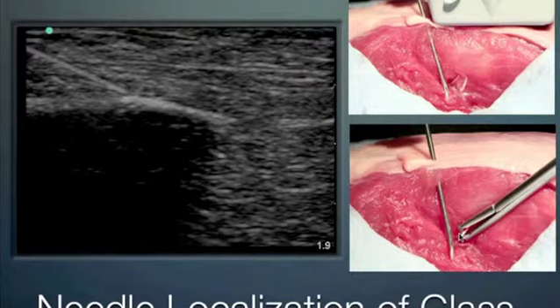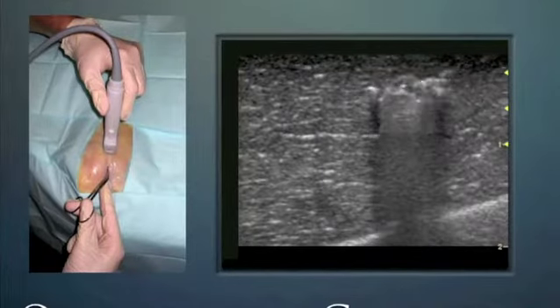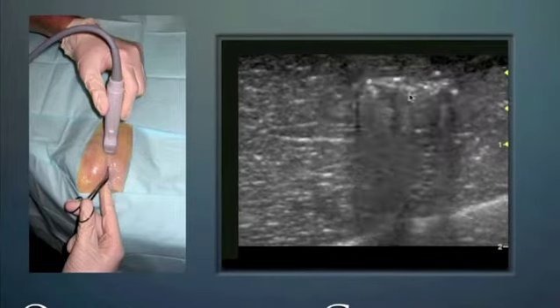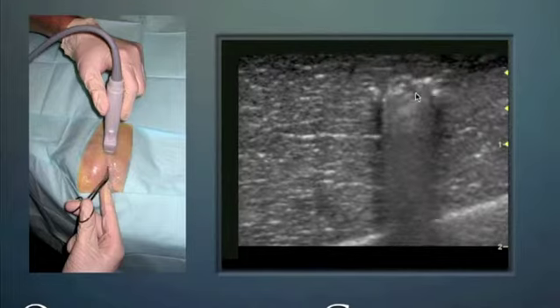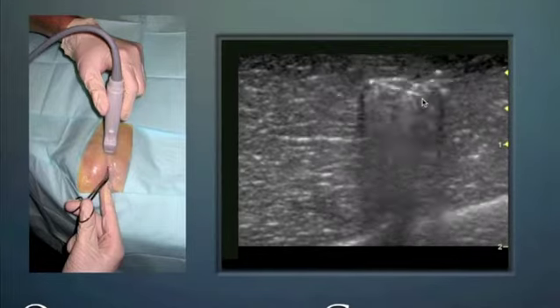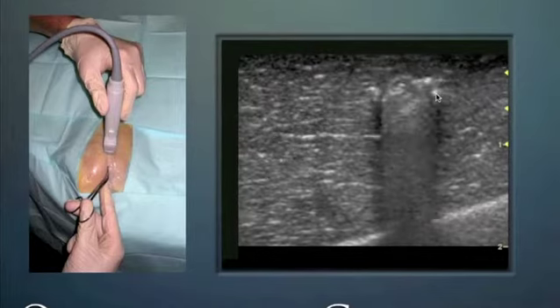And when you're opening and closing a grasping device, this is how it can look underneath the skin on ultrasound. We see these white dots that we see everywhere. That's the air that's in the track that the grasper created. As the grasper goes through the soft tissue, it creates a little air track, and that's what all these little white dots are here.